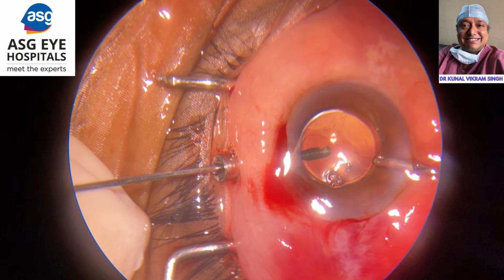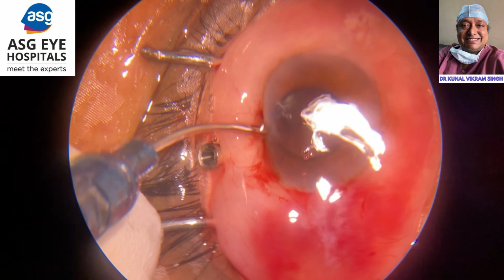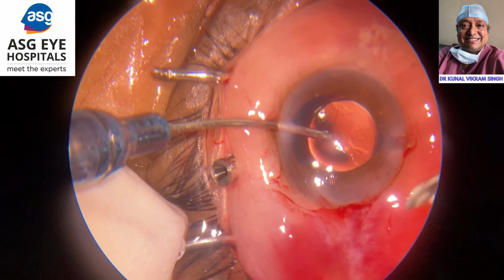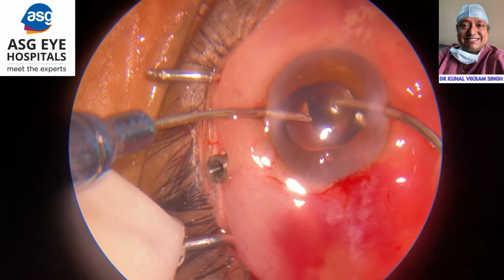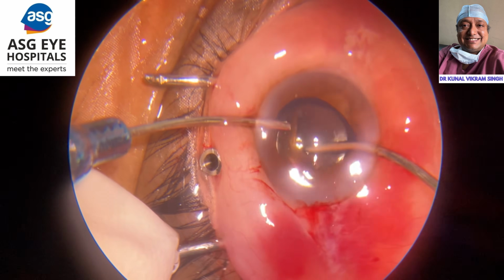All these steps were performed by the retina surgeon, and he really performed them well. No further complication, according to me, can happen now because the AC is nicely formed, and the endothelium was also not damaged. There was no damage to the iris.